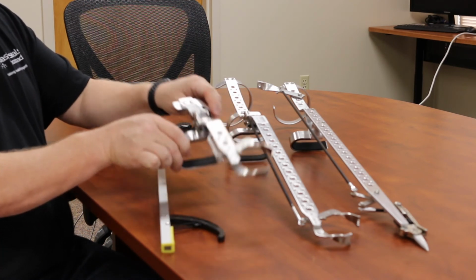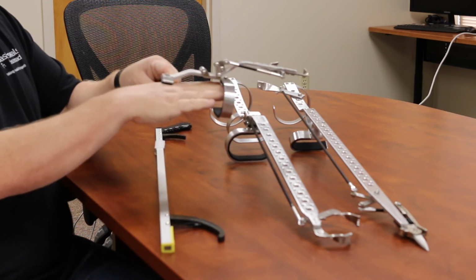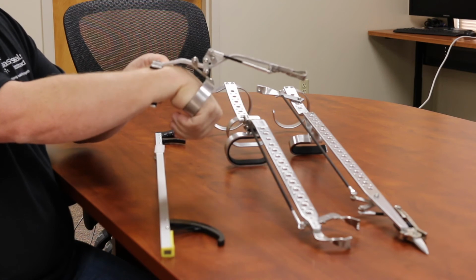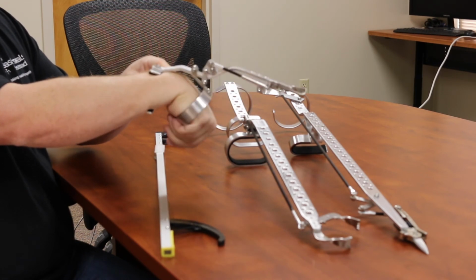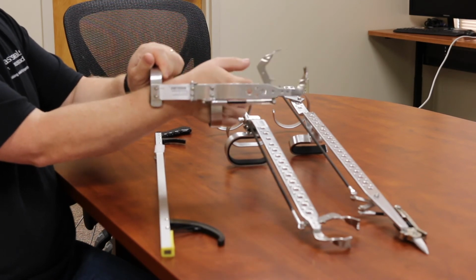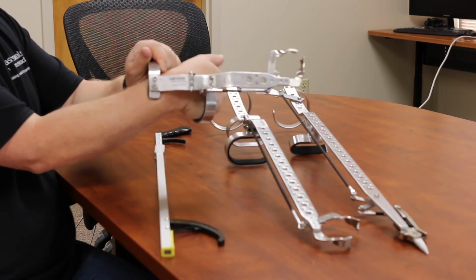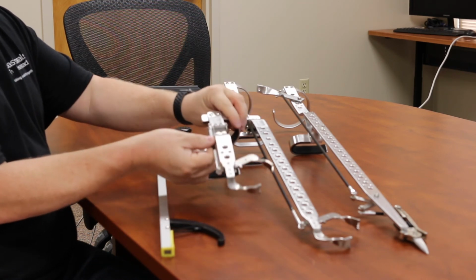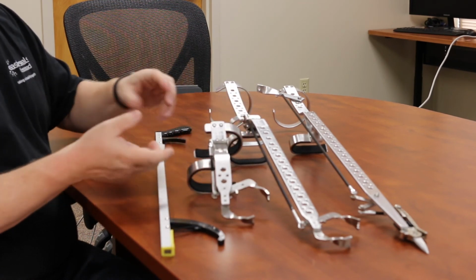If I hold this up, what a person would do is they'd put their arm in the device, and then they would be able to just move their wrist down to be able to grab. I'll turn it to the side so you can see that. You can notice it's grabbing there, and I'm just moving my wrist up and down, so it's allowing me to rely more on those gross motor movements to be able to activate my device.